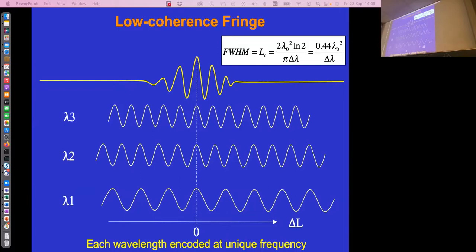The way to look at this, and I will get to that later, is a Fourier transform. Basically, the pattern that you see here, that localization in terms of space, is a Fourier transform of your spectrum. And if you want it to repeat, you need the picket fence pattern in your source to get the repetition of your pulses. Why do you think of pulses? That is because you think of a laser cavity, right? And then you have a pulse traveling back and forth. And every time it has traveled the full cavity length, a pulse comes out. But if you look carefully at the inside of the laser cavity, is every wavelength present in the laser cavity? No. Every wavelength that comes out of the laser needs to match an integer times the cavity length. And so that creates that picket fence in the output of this laser. That creates the repetition.